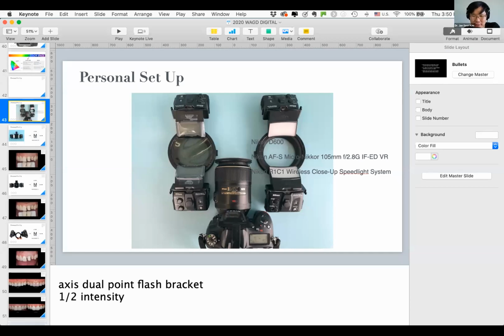Okay, do you think that placing the white balance card behind the incisors like that would cause a reflector effect and mess with the translucency of the incisal edge? Yes. So I probably have some photos where the gray card is touching the tooth. So that's probably not a good thing to do. But I make mistakes too. And I would guess when you're taking that incisal edge photograph, you're not putting it behind there. You're actually taking a separate shot for that. Yeah.